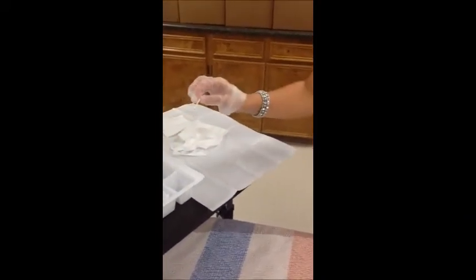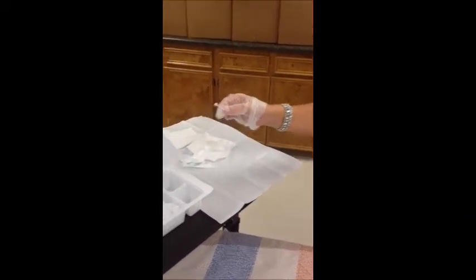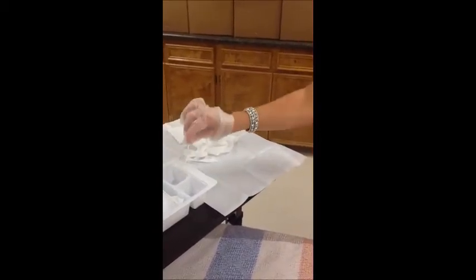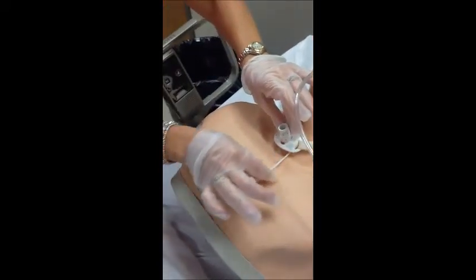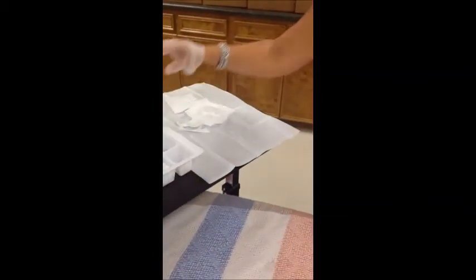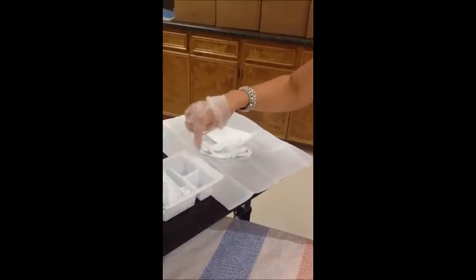I can discard that or I can throw it back over here. I can do peroxide again. But I probably, at this point, if I got it good and clean enough, I'm going to not do the peroxide. I'm going to do the saline to make sure I get the peroxide off around that stoma. I don't want to break that skin down. Patient is without oxygen right this minute, so I'm kind of trying to hurry. I'll take a 4x4. I'm no longer doing peroxide. We're just saline, saline, saline now.